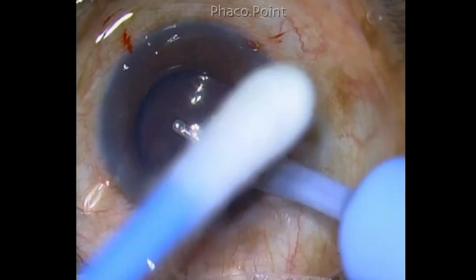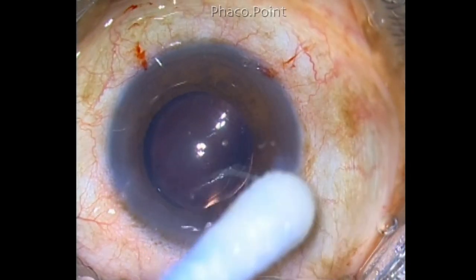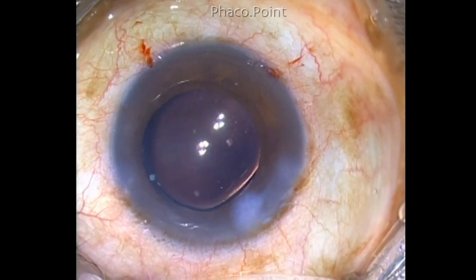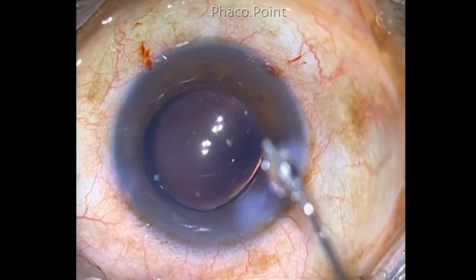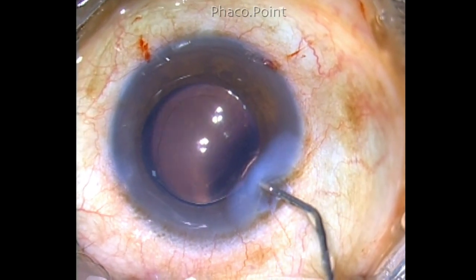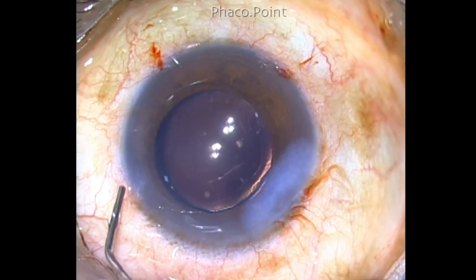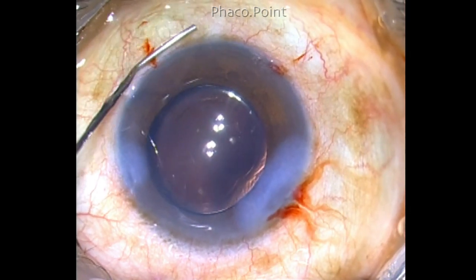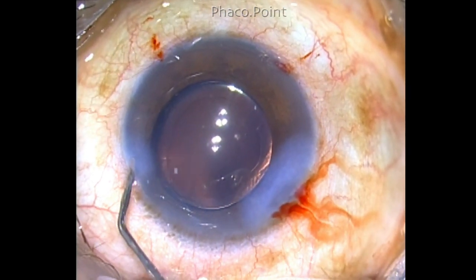Finally, ensure that you've got a good seal of the clear corneal wound. This can be achieved with stromal hydration. As you noticed, at the beginning of the case I created a Wong's pocket — it's a good idea to do so. Just inject a little fluid in the Wong's pocket to create what is called sandwich hydration, and that's it. You can be 100% sure that the wound will seal. You can see how well the anterior chamber is sealed and formed — it becomes deep and the pupil dilates, indicating that the anterior chamber is now safe and secure. At the end of the procedure, I inject a little bit of moxifloxacin and that concludes the procedure.